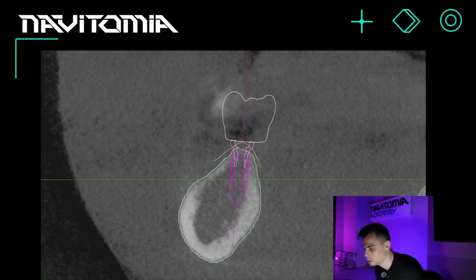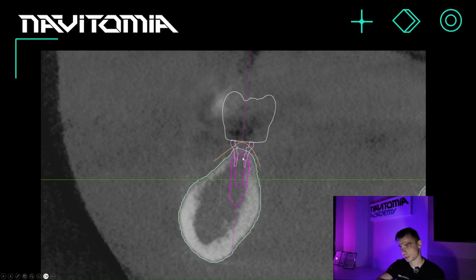So let's take a closer look at this kind of implant placement, specifically at the level of the bone tissue. What's bad about this approach? Actually, there are 2 main drawbacks here. By the way, in the early days of implantology, this is pretty much how implants were placed. There was even a recommendation to place them flush with the bone, and supposedly everything would be fine, and so on and so forth. But what does this lead to?